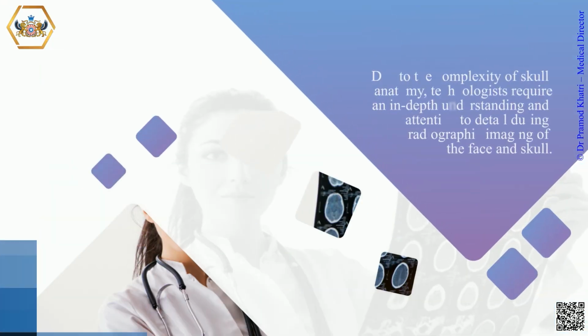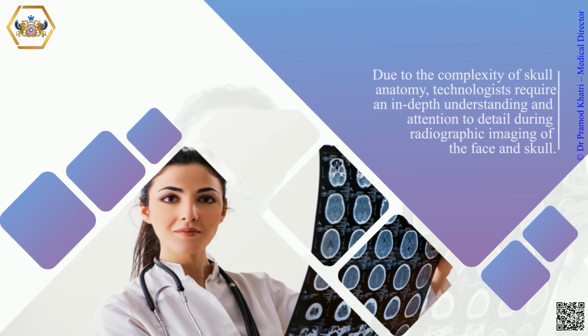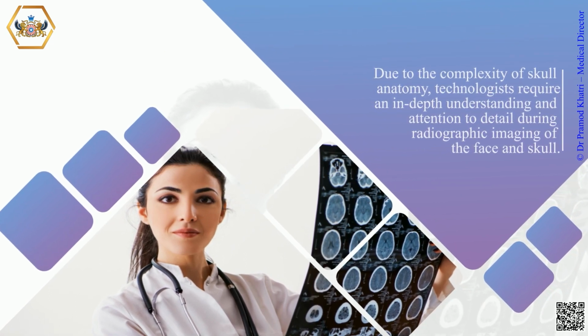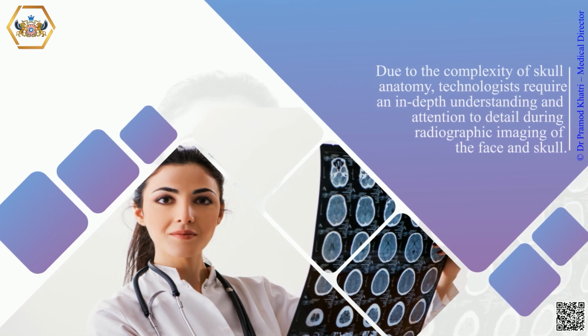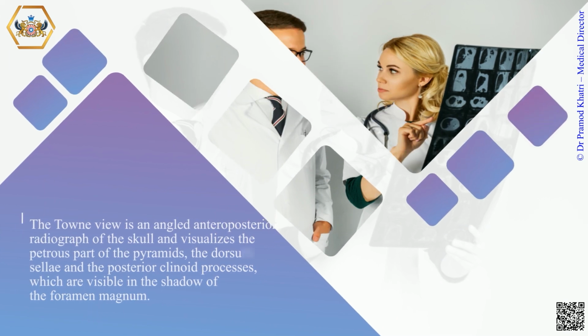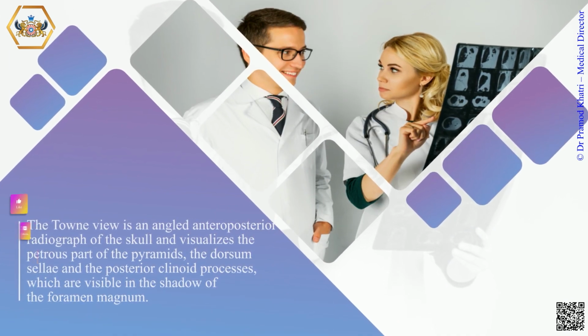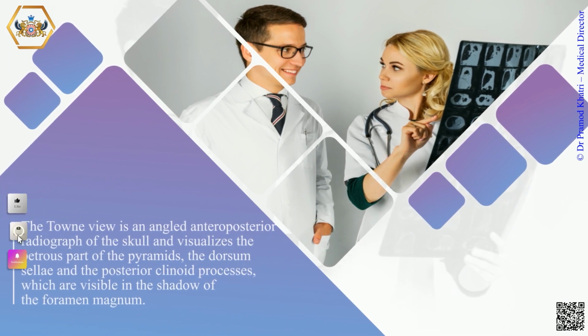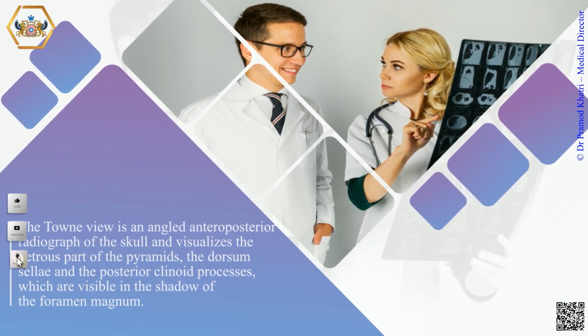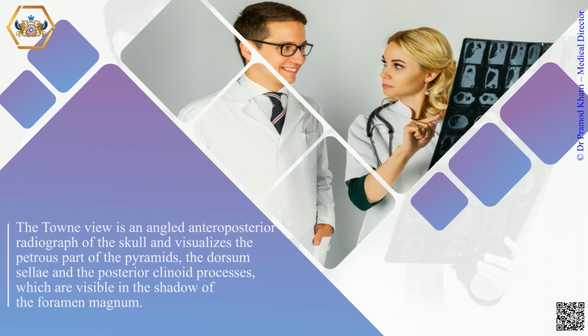Due to the complexity of skull anatomy, technologists require an in-depth understanding and attention to detail during radiographic imaging of the face and skull. The Towne view is an angled anteroposterior radiograph of the skull and visualizes the petrous part of the pyramids, the dorsum sellae and the posterior clinoid processes, which are visible in the shadow of the foramen magnum.